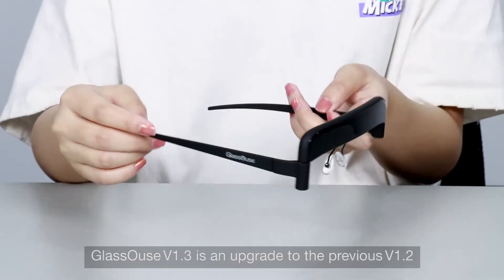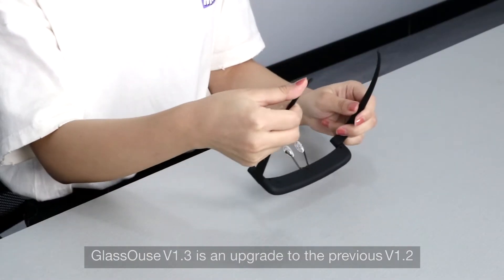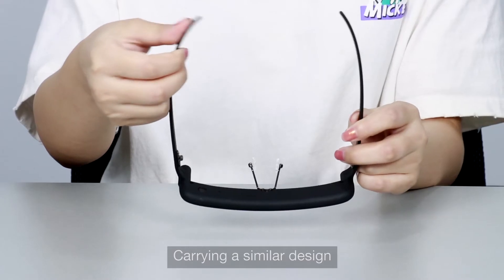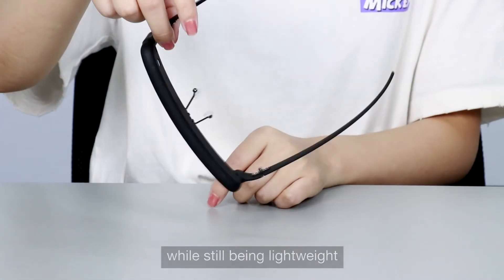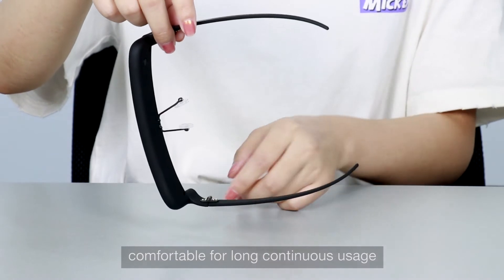GlassOuse V1.3 is an upgrade to the previous V1.2. Carrying a similar design, the new version has a stronger material build while still being lightweight, making it comfortable for long continuous usage.